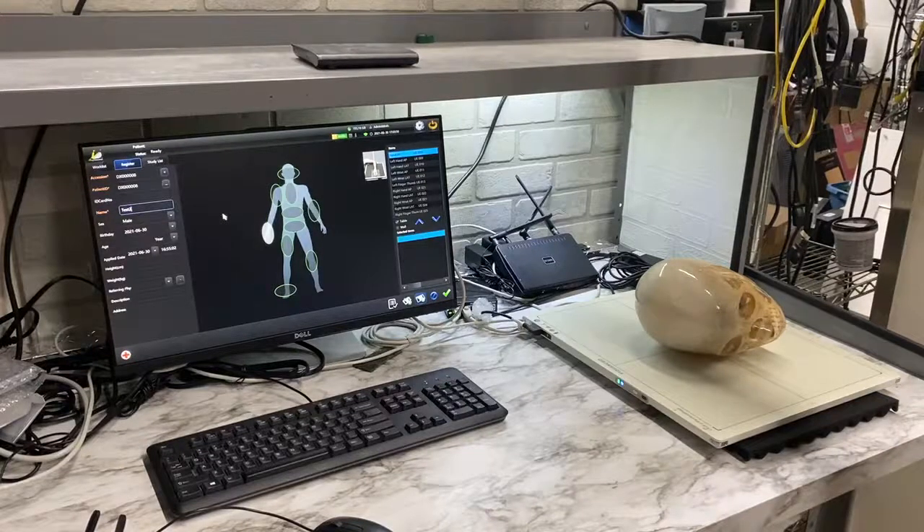Hello, today we're going to do a video demonstration of the iRay DR panel. These are new equipment that will take your existing x-ray room and upgrade it to digital.